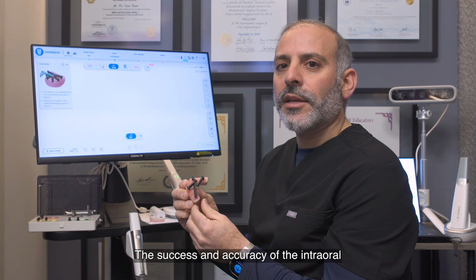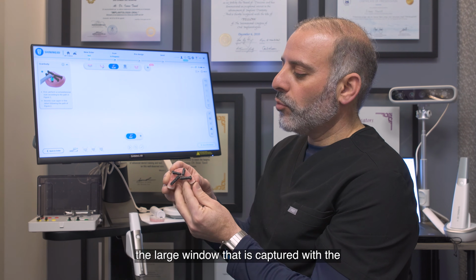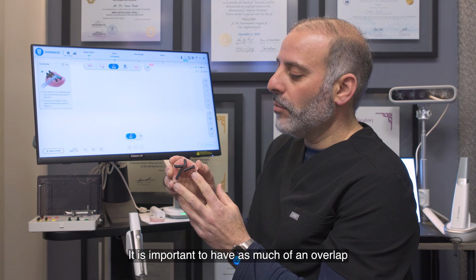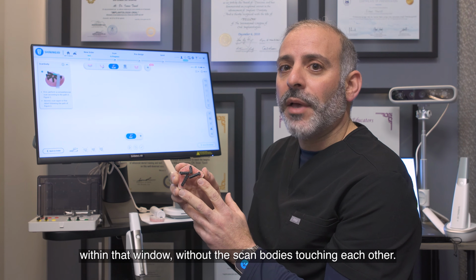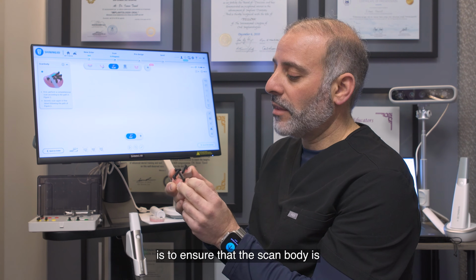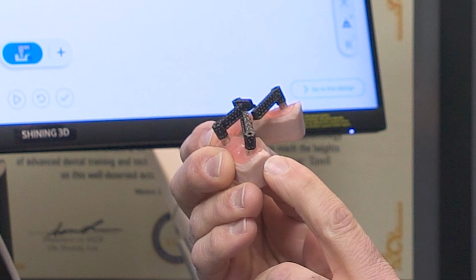The success and accuracy of the intraoral photogrammetric system relies upon the large window that is captured with the intraoral photogrammetric tip. It is important to have as much of an overlap within that window without the scan bodies touching each other. The purpose of the scan bodies not touching each other is to ensure that the scan body is flush and fully seated on the multi-unit abutment.